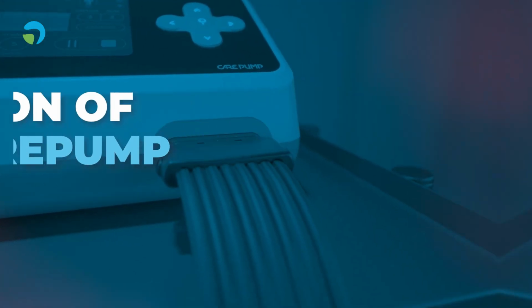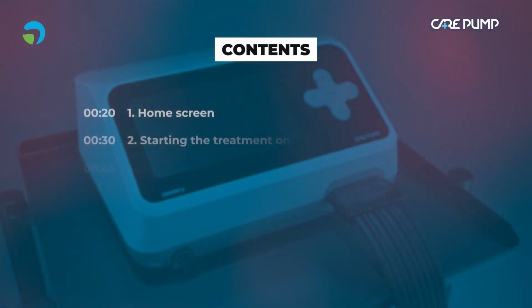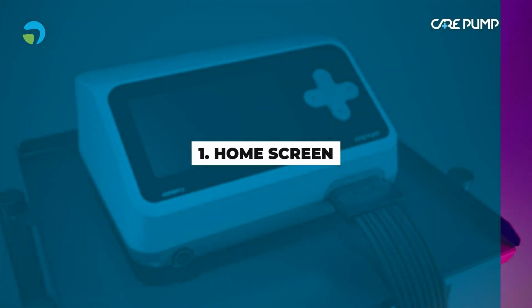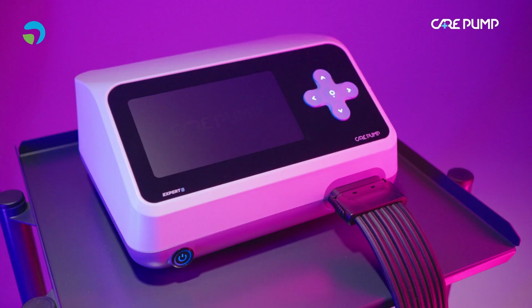Operation of CarePump Advanced Series based on Expert8 device as an example. Home screen. Start the device by pressing the power button. The home screen will appear.